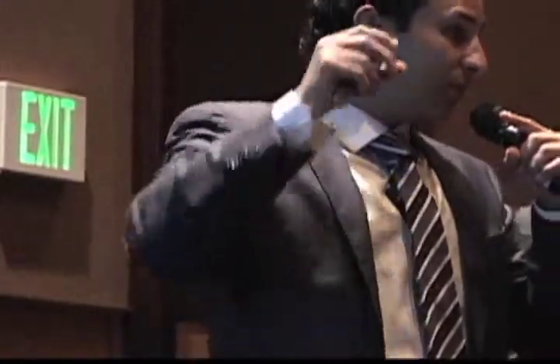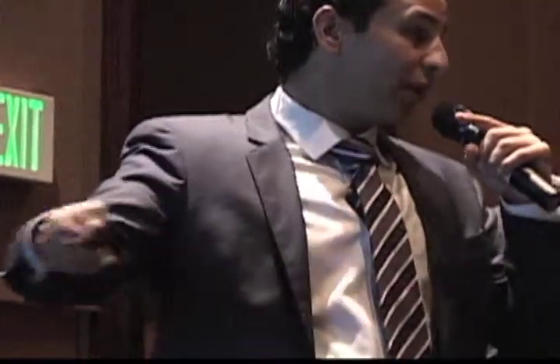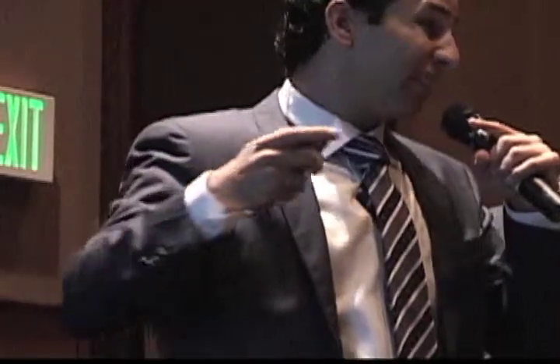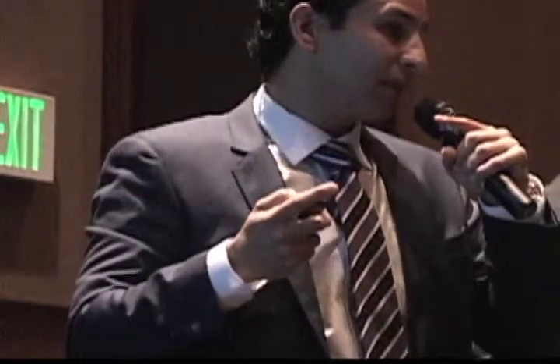You can sometimes, instead of having all white, have pink porcelain for that area as well. But if they have a high smile line, they may not like pink porcelain either. Okay? These are all discussions we need to have. Managing and talking and communicating with your patient is key.